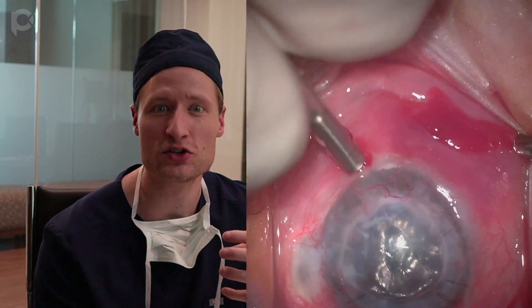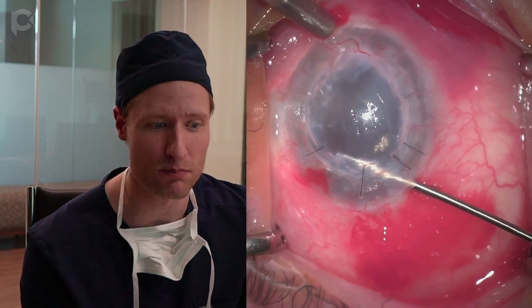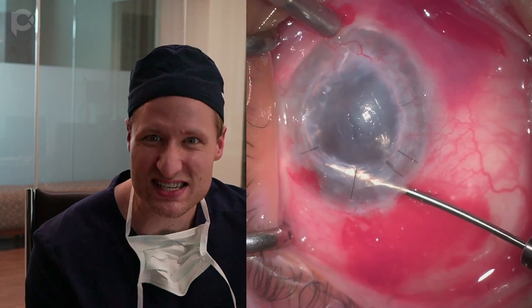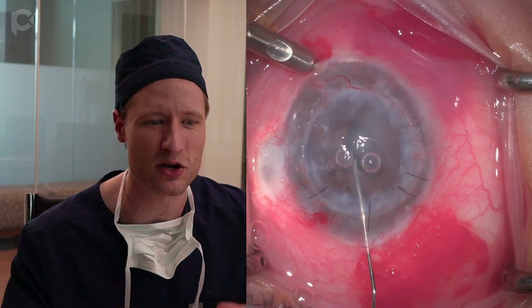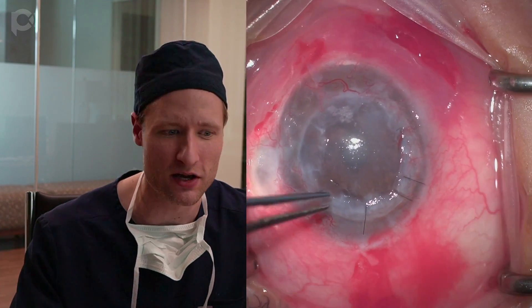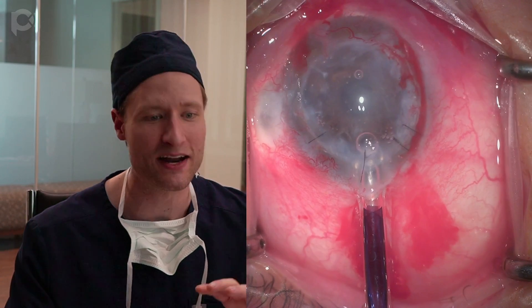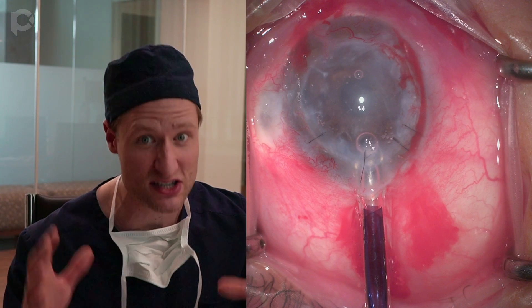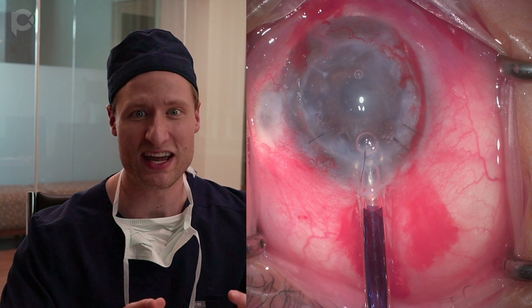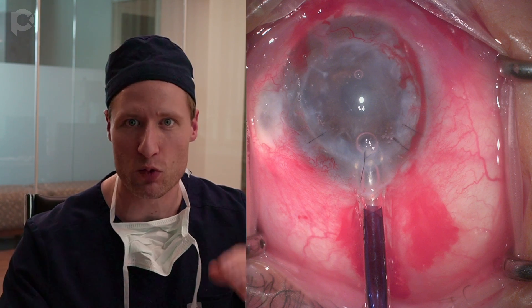I size the graft typically one millimeter smaller than the measured PK diameter in the office. This patient's graft was 7.75 millimeters, so I'm using a 6.75 millimeter graft — giving me the most cells but also freedom from interacting with the edge. I'm not removing all the epithelium, but I am removing some of the scarified fibrotic epithelium around the edges of the graft so I can see what's going on at the edges of the transplant — specifically the graft interacting with the edge of the PK.